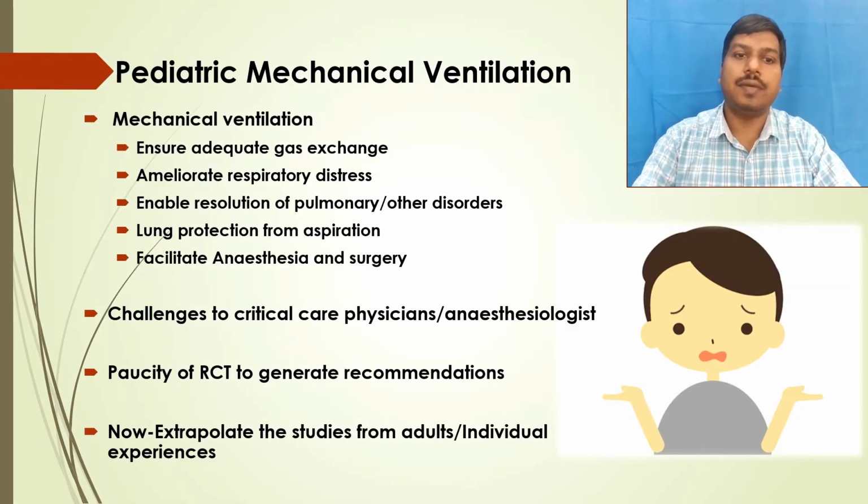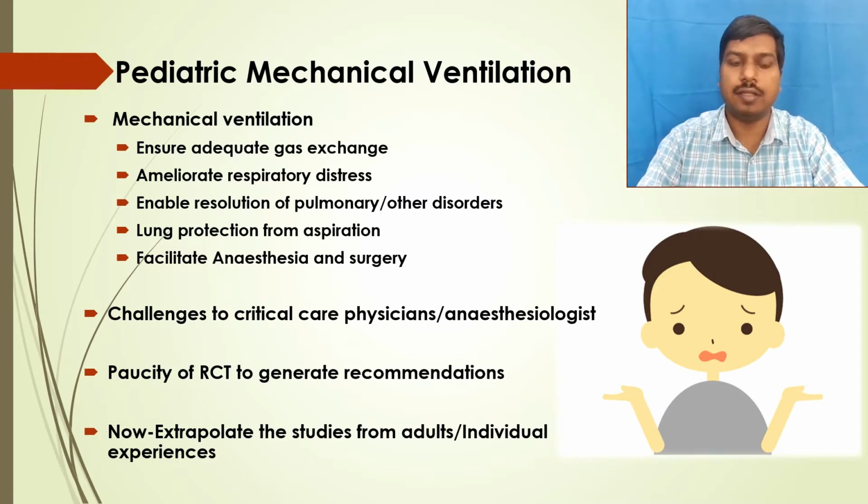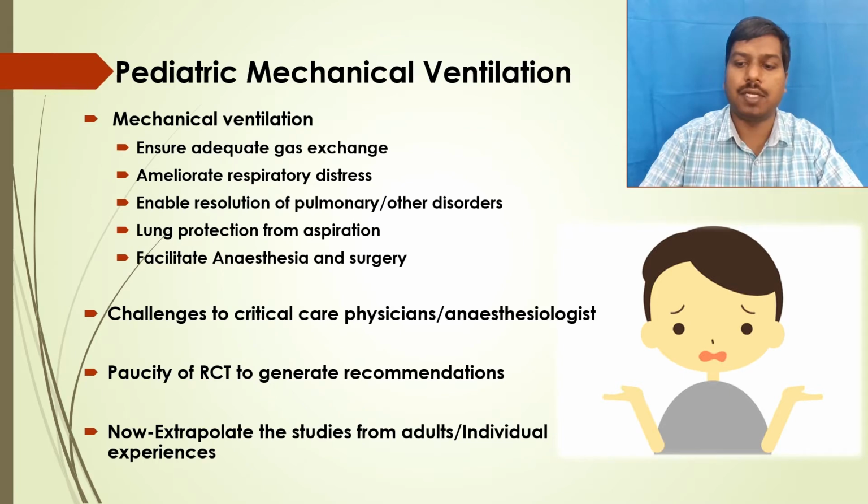So we ventilate pediatric patients to ensure adequate gas exchange, ameliorate respiratory distress, enable resolution of pulmonary or other disorders, protect the lungs from aspiration, and also to facilitate anesthesia and surgery. Even though we ventilate a lot of pediatric patients every day, it's always a challenge to the critical care physician as well as the anesthesiologist, because there is a paucity of randomized controlled trials and recommendations for pediatric mechanical ventilation. So now what we are doing is to extrapolate the studies from adults as well as individual experience to the pediatric population.